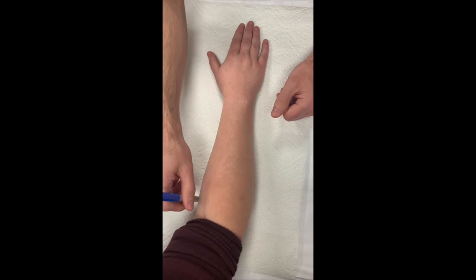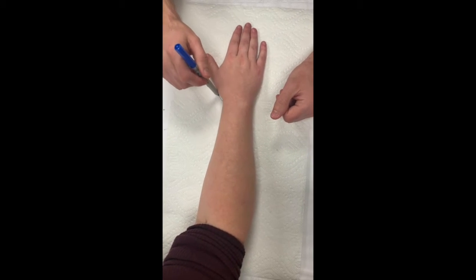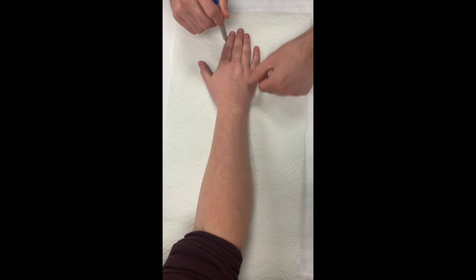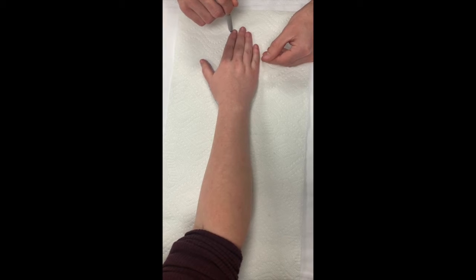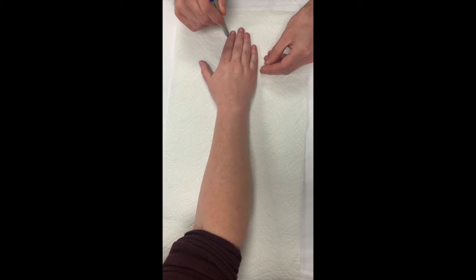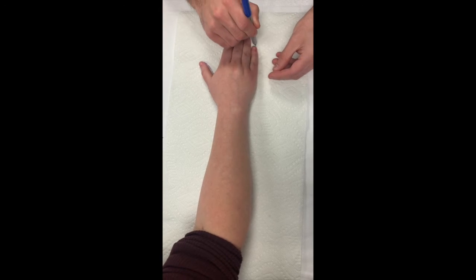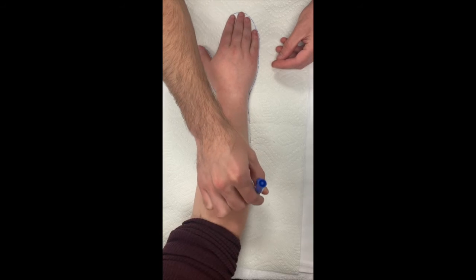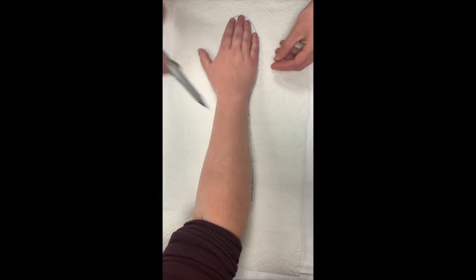Place the client's hand, wrist, and forearm on the paper towel. Make sure the digits are in full extension and the thumb is in abduction. Place the pen in between the radius and ulna and make sure to not ulnarly or radially deviate the wrist.